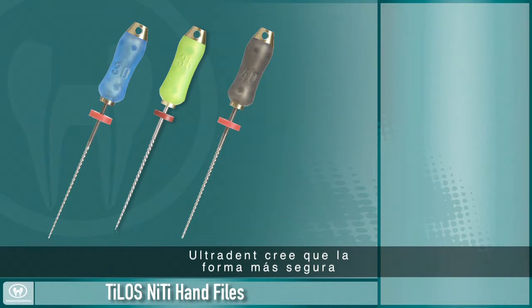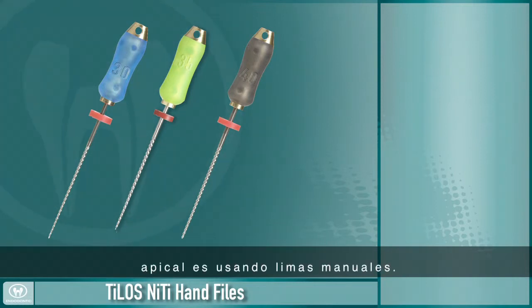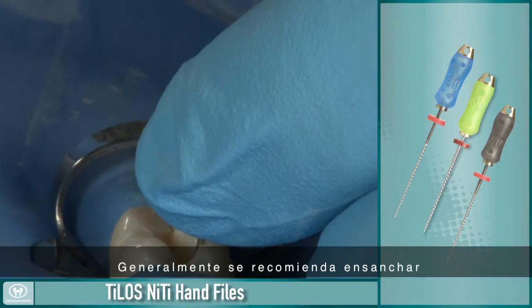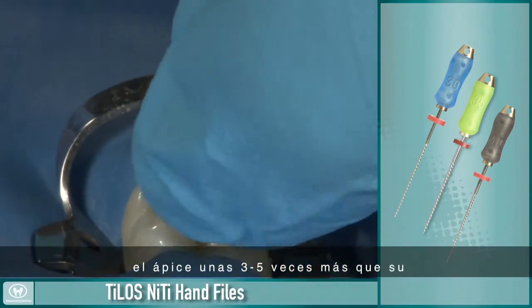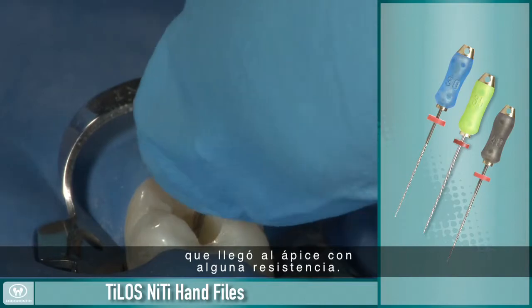Ultradent believes that the safest and most accurate way to finish enlarging the apical opening is by using hand files. Use the TiLOS NiTi hand files to finish the apex of the canal. It is generally recommended that you enlarge the apex 3 to 5 sizes larger than your apical instrument, which was the first file that went to the apex with some resistance.